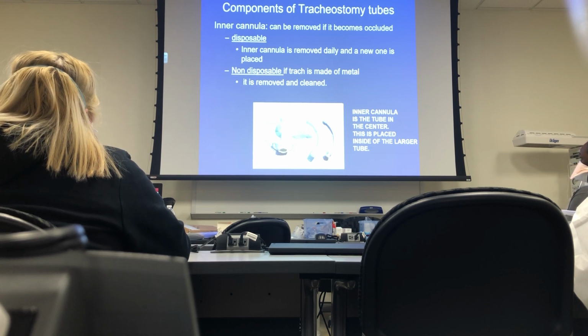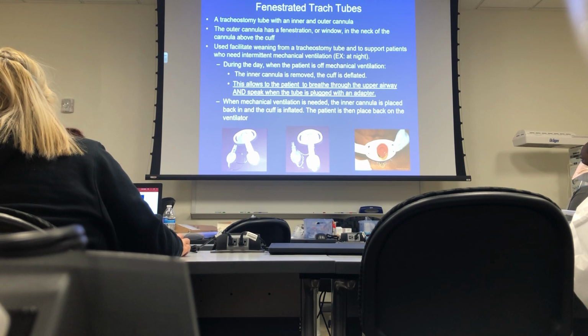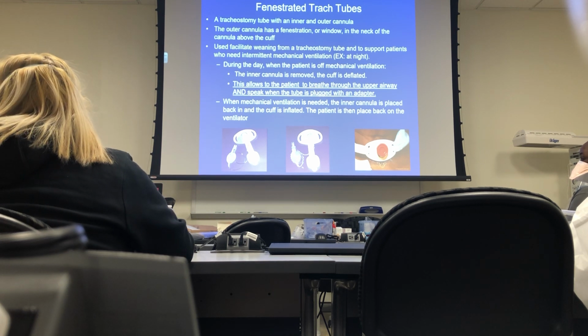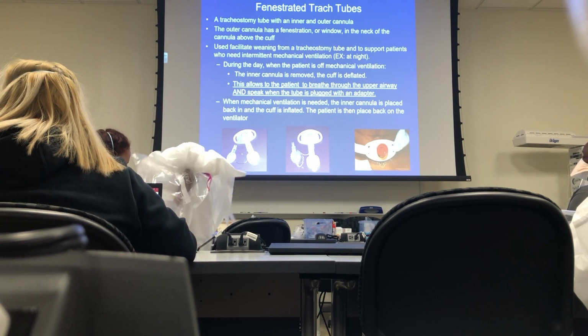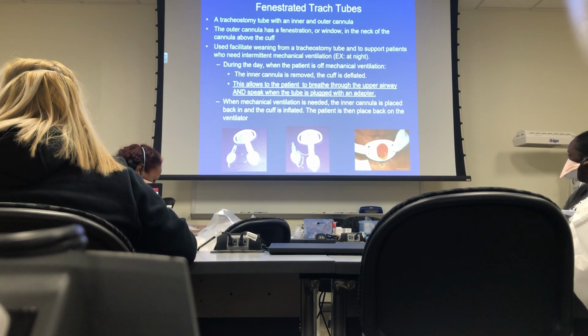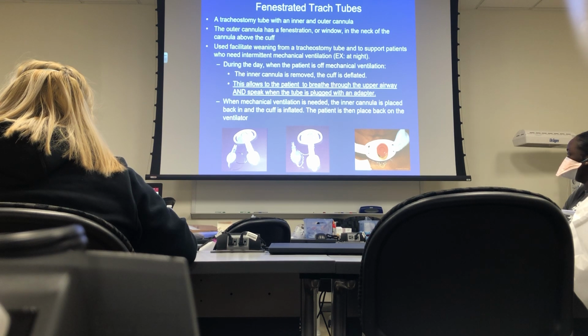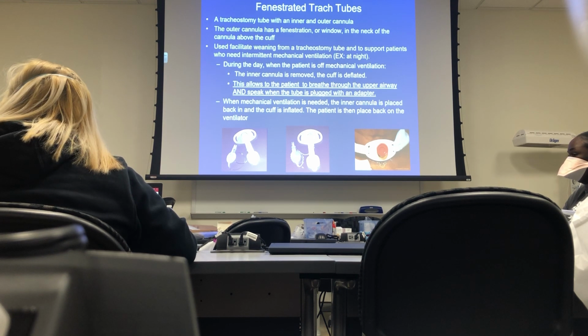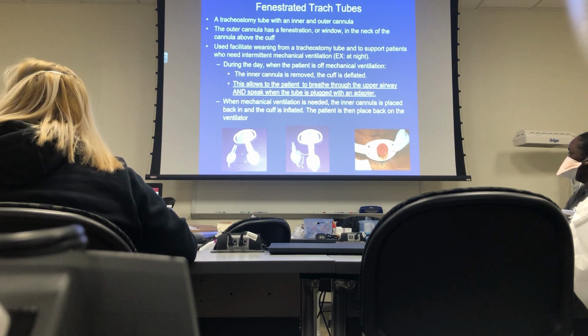Okay. The fenestrated trachs are used on people who may be off the ventilator during the day, but they have to go on the ventilator at night. A fenestrated trach tube will allow them to get used to using both their upper airway and the trach site. It will allow them to talk, okay? And they can eat if they can swallow.